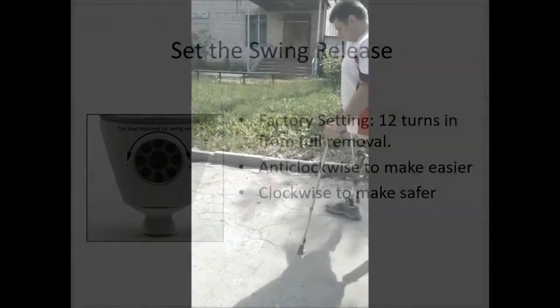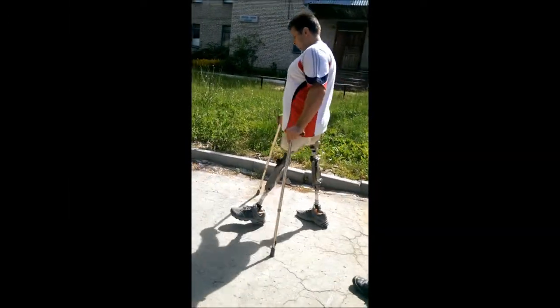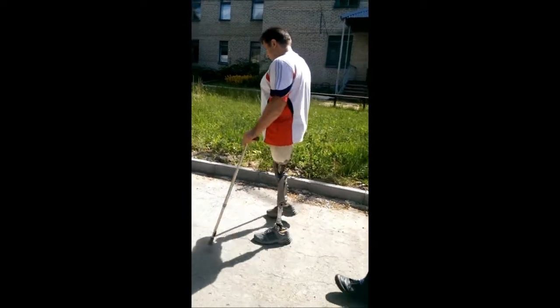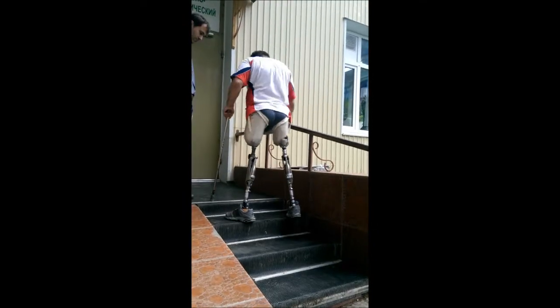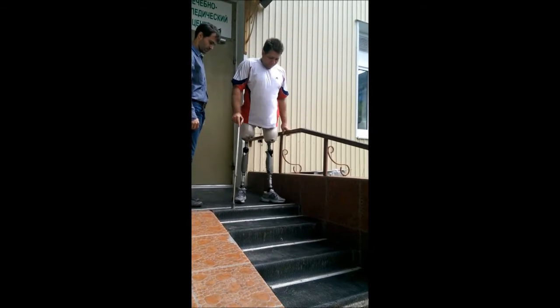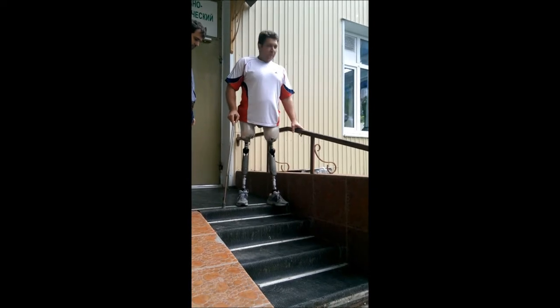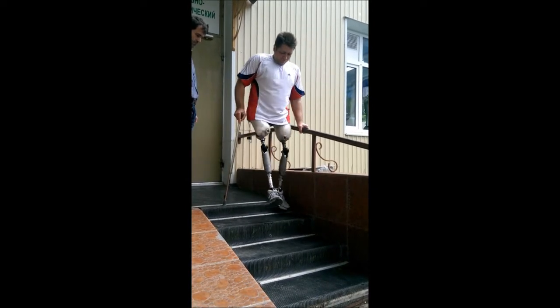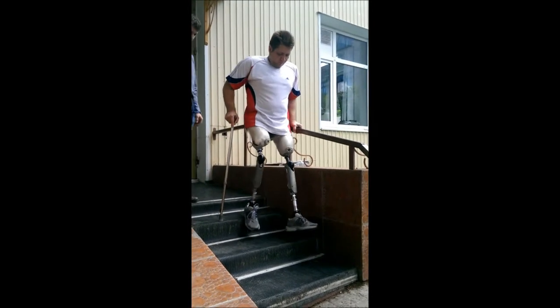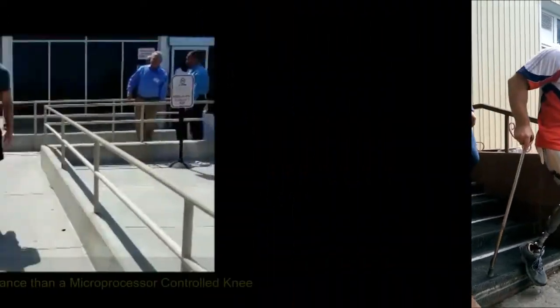Where this comes into key is in a bilateral. You want to give them a little bit more resistance because you don't want to inadvertently go into swing, and yet you want them to go into swing. Because a bilateral doesn't have a choice on loading the leg. They have to load the leg. It's very easy for them to initiate swing. But they want resistance. So we want stance to be a little more aggressive, so add a little bit more resistance to that toe load.